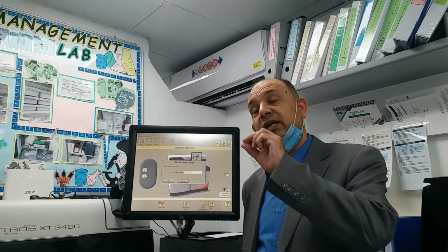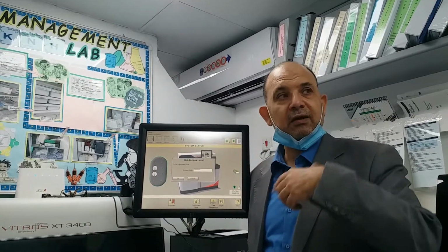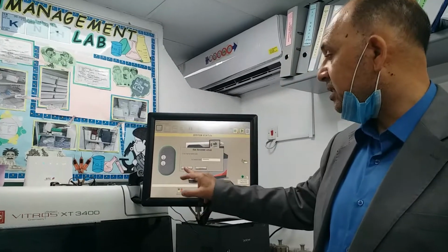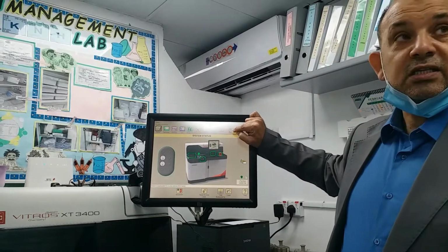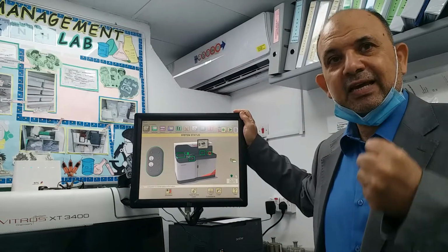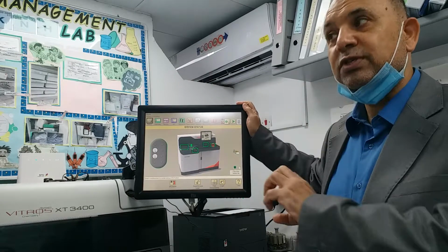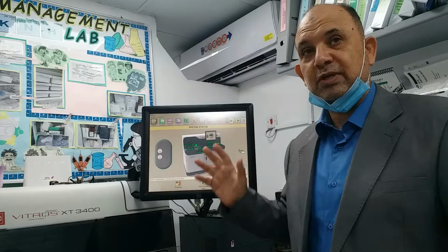If you would like to use a higher password, use the application one. It's safe. It will not give you any critical tool or anything that leads to stopping the machine. So I'll say just okay. See, instead of the blue lock which we had before, now it has become red. That means you are in a very critical situation for using the software of the system. Anyway, I leave it because I need to do something on that one.